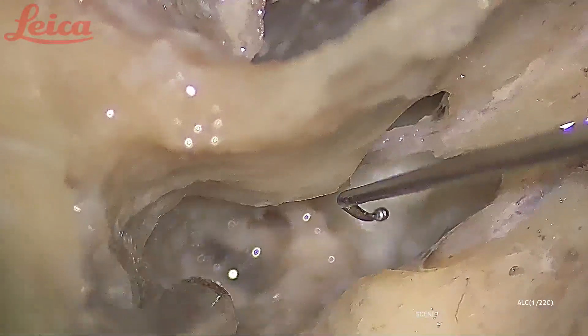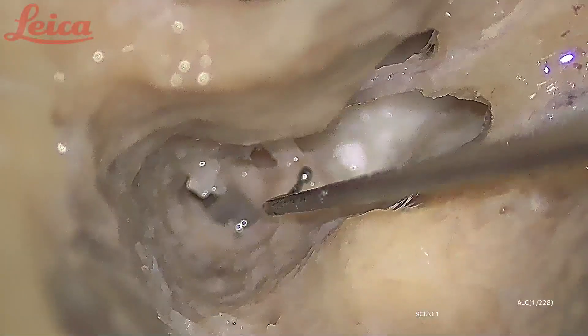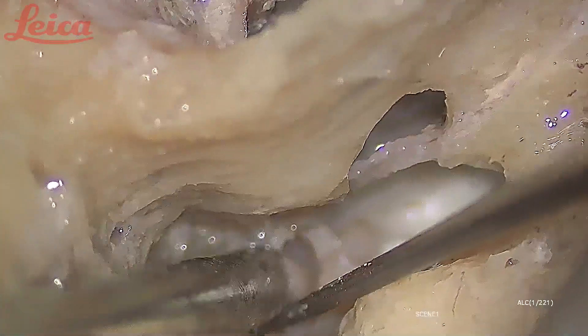This is the process cochleariformis here — that is a very good landmark, because even in chronic ears the process cochleariformis is rarely eroded; it is always consistently there and is a good landmark for the facial nerve as well. This is the tensor tendon, which attaches to the neck of the malleus. I cut the tensor tendon before removing the malleus because it is difficult to remove the malleus if the attachment is still intact.